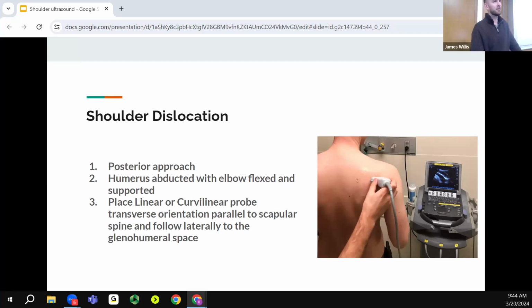So you're going to be behind the patient. The patient is going to be sitting with supination of their hand. They rest their hand on their thigh like this, and you're coming from the back. And you're going to orient your probe whatever makes sense. Most of the time we say to the patient's right shoulder, but if you're looking at the ultrasound and the patient is here and you want to have it to the left because it makes sense for you, then I think you should probably just do that instead of following dictated where the probe marker should be.